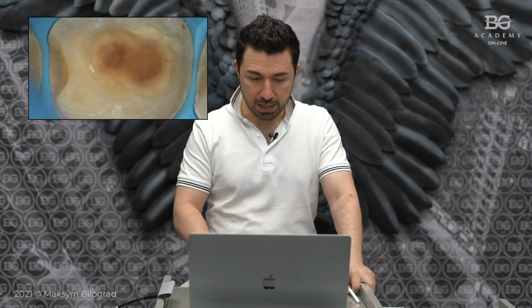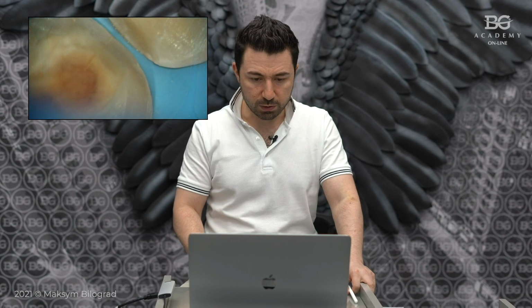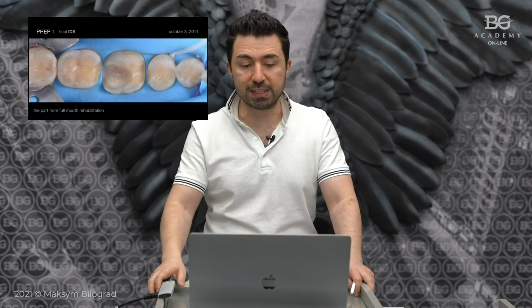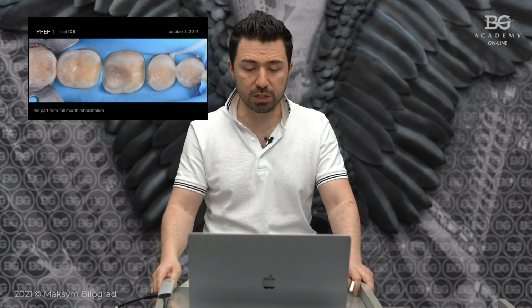Okay, so next, you see here a macro picture when caries was removed: small crack lines in the enamel that are partially indenting. These cracks are not stained, they are not deep, so you can seal them with adhesive materials and nothing will go wrong. This is the step of adhesive sealing, so basically it is immediate dentin sealing. All dentin was sealed with composite and bonding agent.